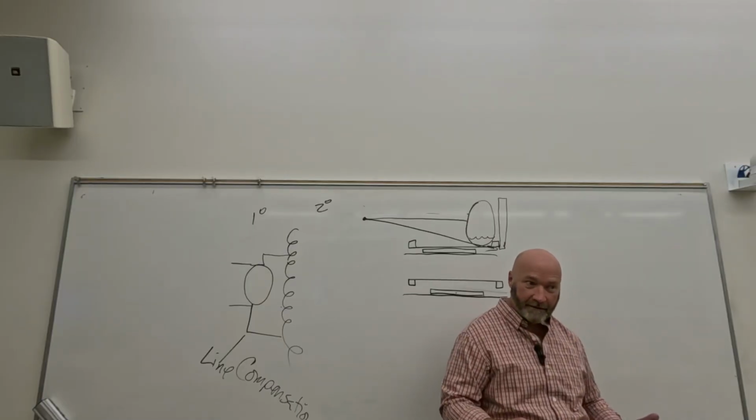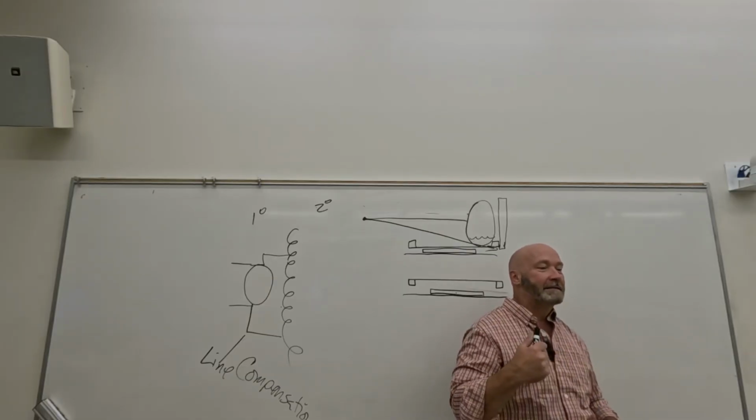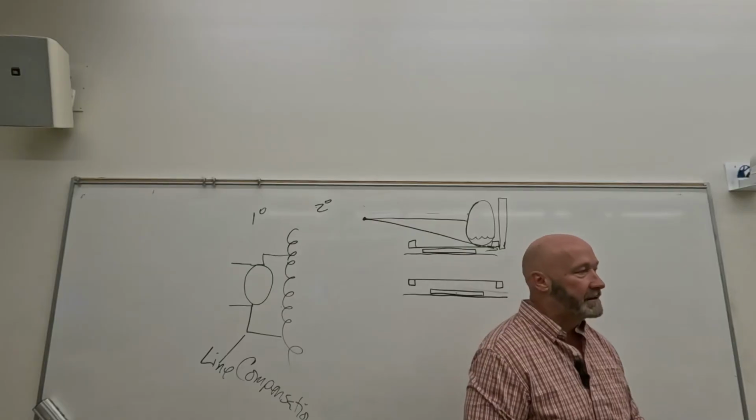I think somebody said it. Magnets? Okay, magnets. Specifically, we call that type of magnet almost a solenoid, right? So you step on it, it goes clap.